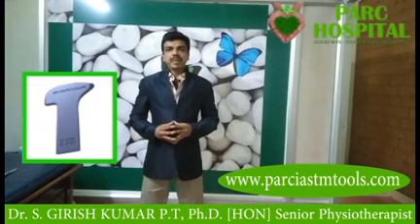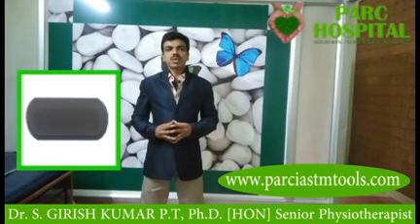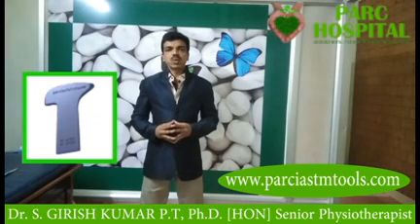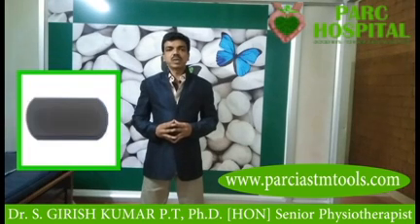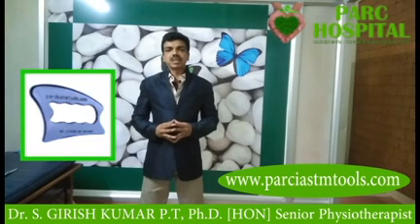The idea behind the introduction of our Parc IASTM tool is that I was thinking to make an IASTM which is simple, user-friendly, anti-allergic, unbreakable and durable to release myospasm. The final outcome is the Parc IASTM tool.